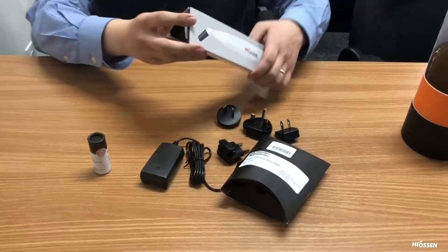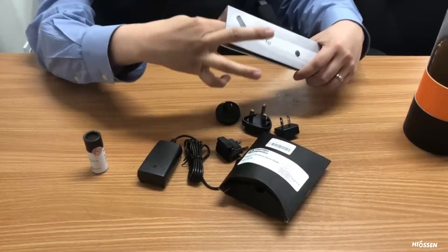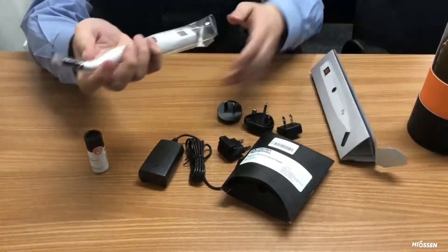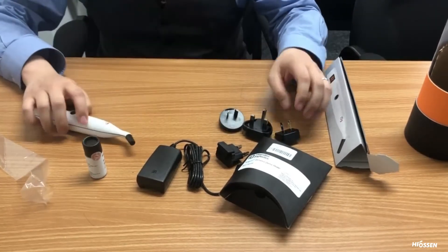If you pull on this little tab here, you can reach in and bring out the IS3. It's got a sleeve on there, so I'll just take that off for now.